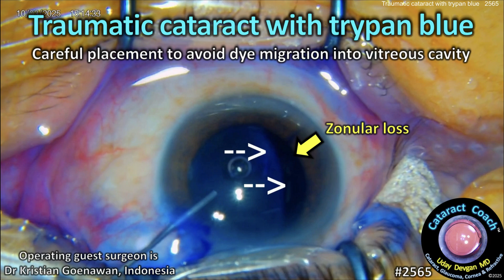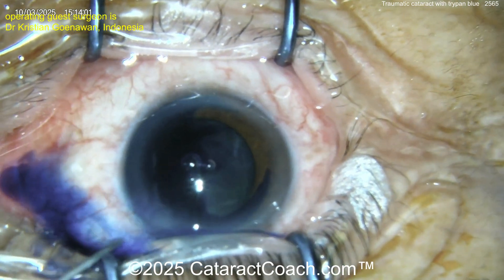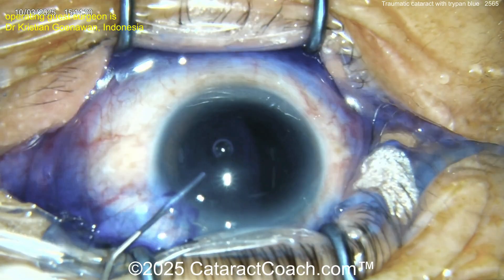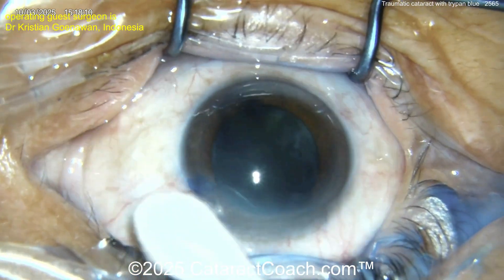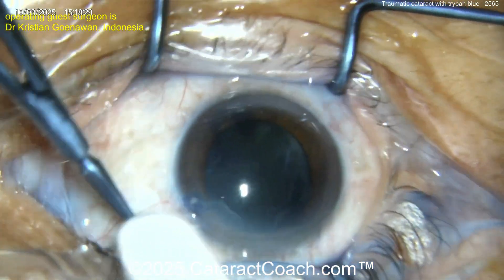CataractCoach.com — traumatic cataract with trypan blue, but you have to avoid migration of the dye into the vitreous cavity. Starting off with the paracentesis and blue dye going in — look what happens as you put the blue dye in. Where does it go? That huge gap right there is the lens equator — that huge gap is zonular loss, meaning all that dye just went into the vitreous cavity.